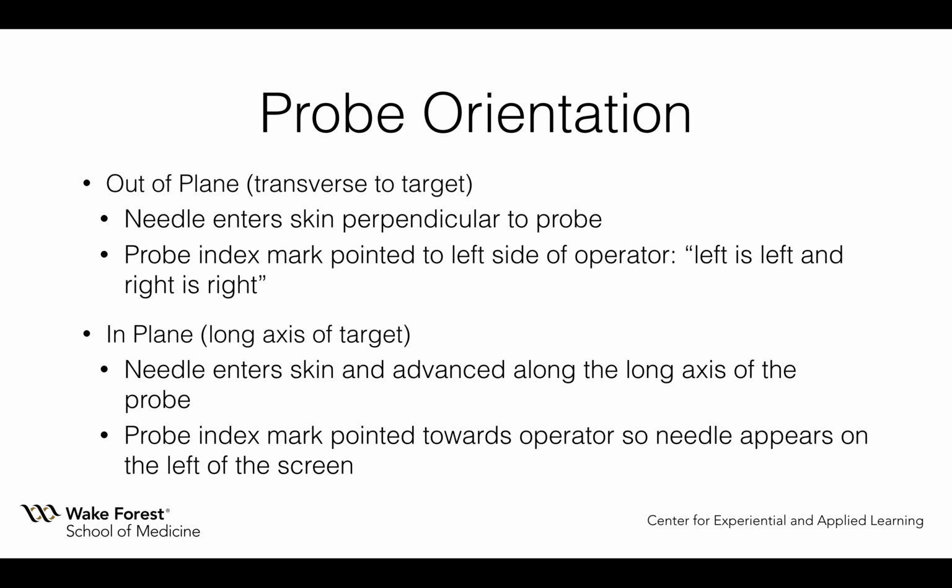All right, we've discussed how to identify the needle tip in the image and how to set our picture up. When it comes to actually holding the probe, we want to generally keep the probe in a standard orientation. So if we're doing an out-of-plane approach, most of the time we should have the index mark, the part on the probe that lets us know which side is which, towards the left of the operator, or the person doing the procedure.